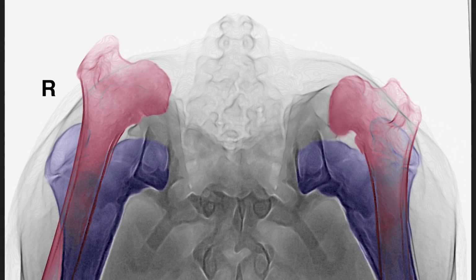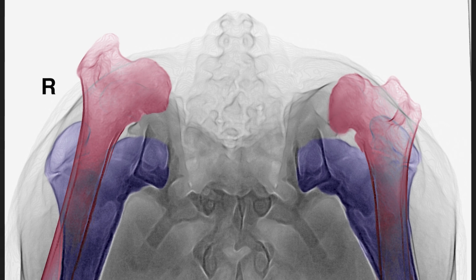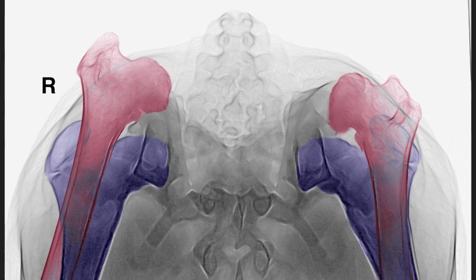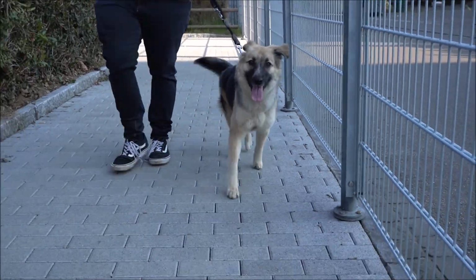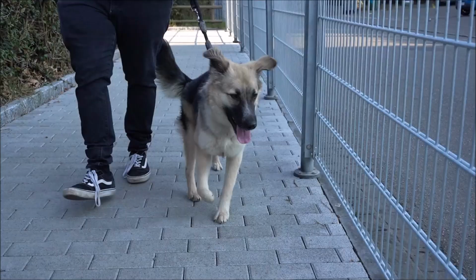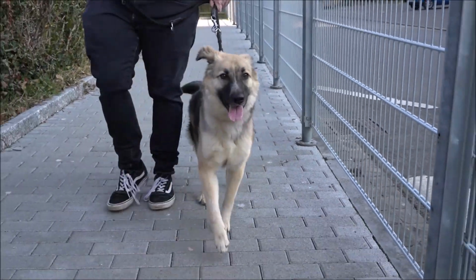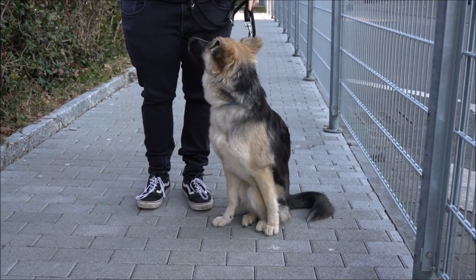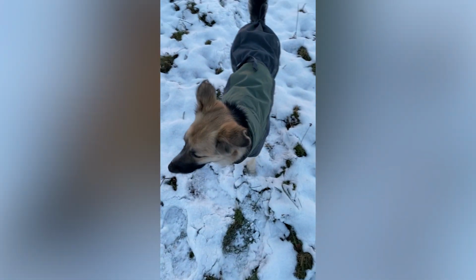The standing DAR technique should show this. A normal hip is colored in blue and Frida's hip in red, when TEP was not yet present, as seen on the video and X-rays. Although Frida is doing better, a second operation for the defective hip joint is unavoidable. However, if the second operation adjusts the length of the limbs, as well as allowing the femoral head to move in the socket, we can restore Frida's quality of life.